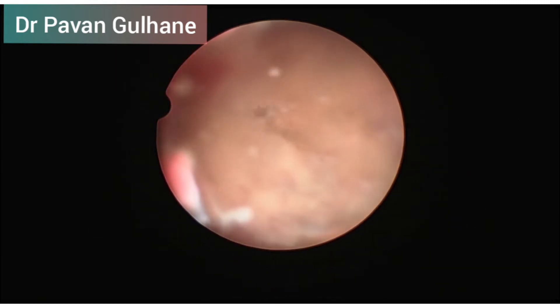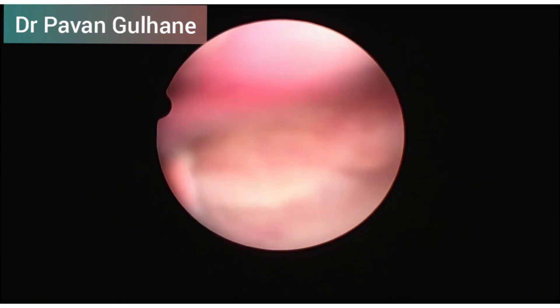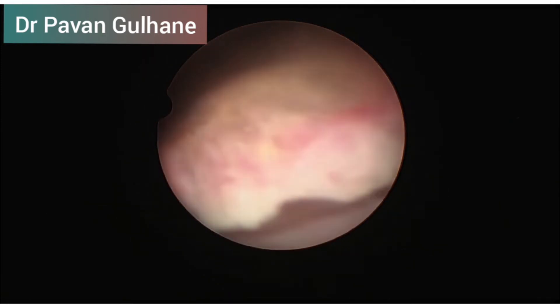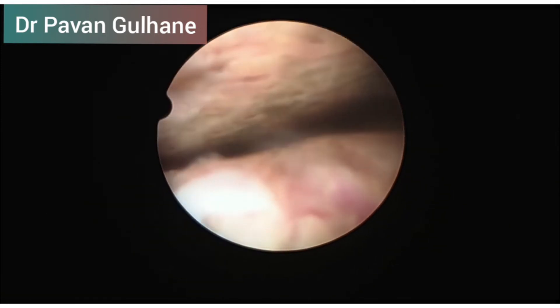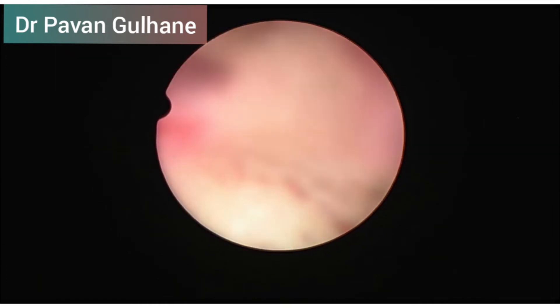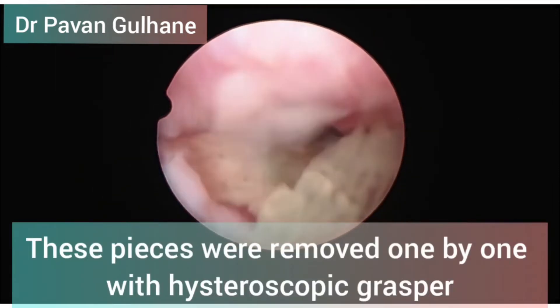One of the most common differential diagnoses for this pathology is a patient who has undergone second trimester abortion where a few bones from the fetus have been left inside the uterine cavity.